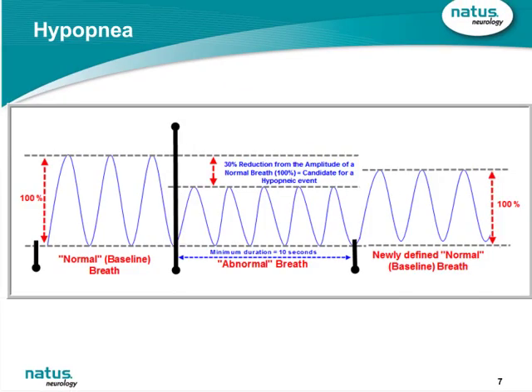When we're talking about these amplitudes, some people have asked, when you're looking at the analyzer, it's not a moving window. So as the software is going through and attempting to compute an average baseline, it's not going to just look at the previous 10 seconds or 20 seconds. It's not that simple. If you imagine someone who's experiencing respiratory events, someone could be experiencing an apnea for 10 seconds, and then they take a few breaths, let's say another 2 or 3 seconds of normal breathing, and then they go back into another apnea.